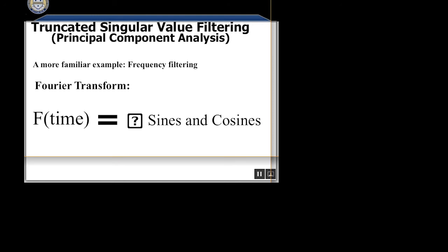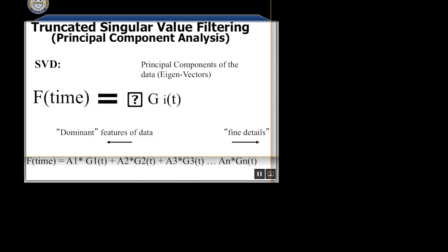With the frequency, we decompose in frequency, cut out some of the frequencies and rotate back. With principal components, it's the same sort of concept, and I'm sorry my equations are failing a little bit. We can take our data and decompose it into this principal component space. We can identify which of those principal components look like cardiac or respiratory. We zero them out, and then when we rotate back to the original space, that feature has been removed from the data.